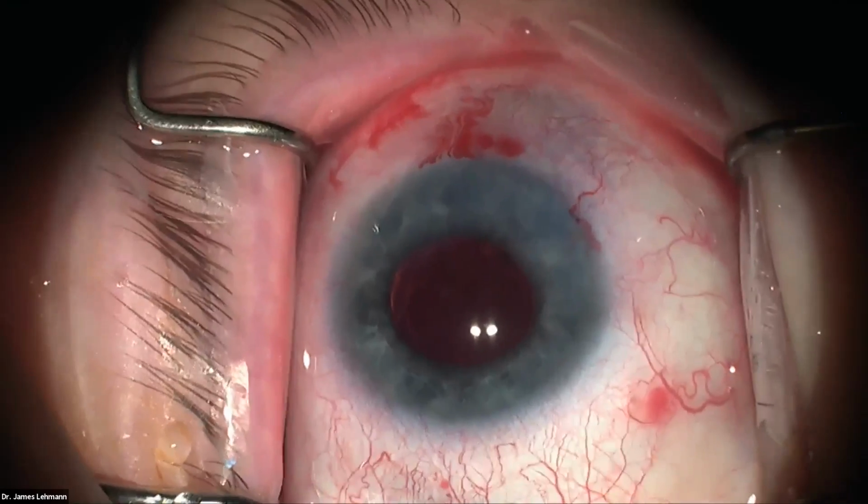Well, thank you, Dr. Lehmann. That was a beautiful demonstration. I think one of the key things to look at is his use of viscoelastic agents. Obviously, we use viscoelastics to protect the endothelium. During cataract surgery, you're worried about 3 types of injury to the endothelium: direct mechanical trauma from the lens coming up and hitting the endothelium, the energy from the phaco, so phaco trauma, and then obviously fluidic trauma. You don't want to run a lot of fluid through the eye. That's one of the things I think you appreciated from Dr. Lehmann's case, was how little leakage he had from his wounds.